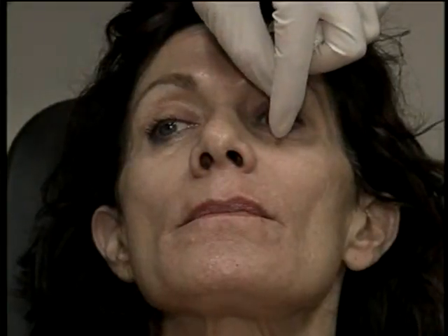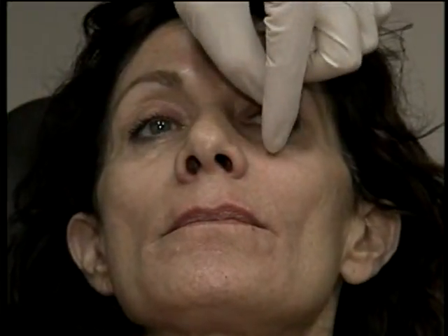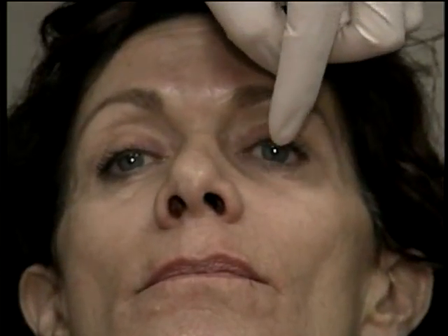I bring the chair back a little bit. Just back a little bit. Okay, good. And I have the chin up. Now, where I'm looking to treat is the infraorbital nerve, which is right about there. And I recognize that from spending a lot of time in surgery. I know where that's at. But if you follow the mid-pupillary line down, it's about where the infraorbital nerve is.